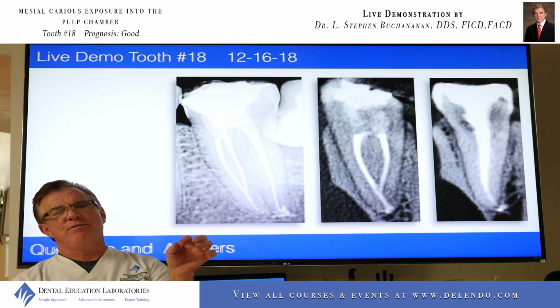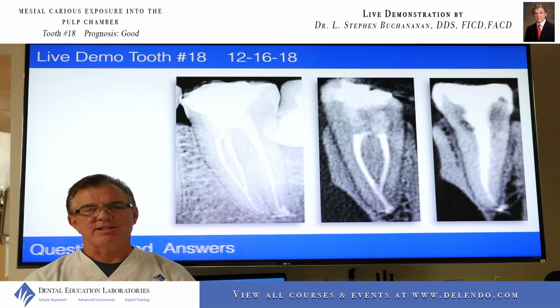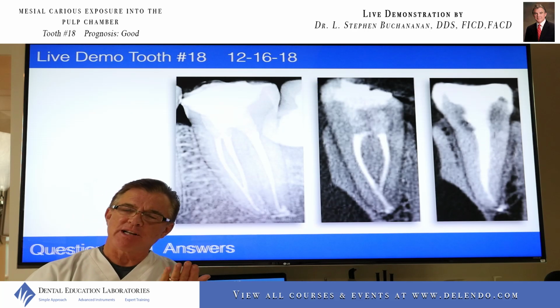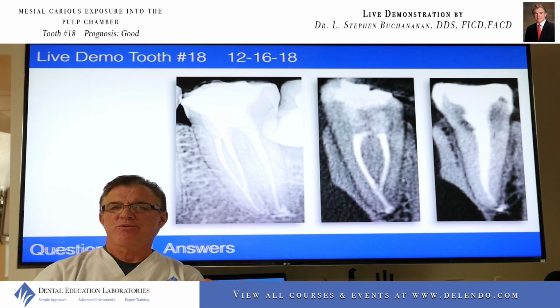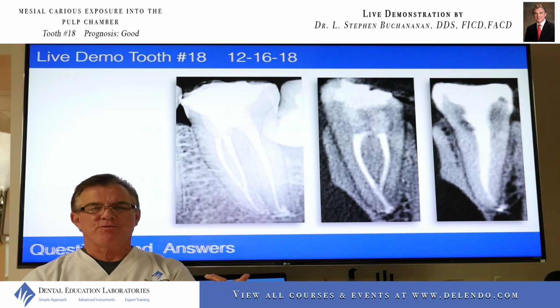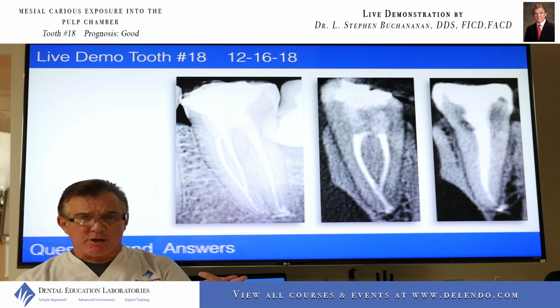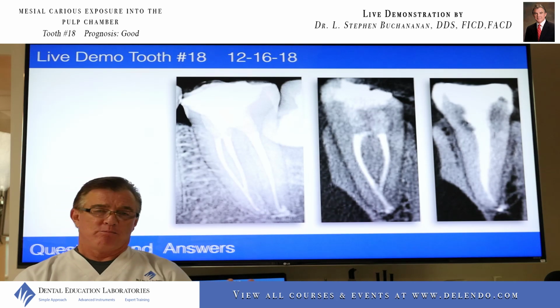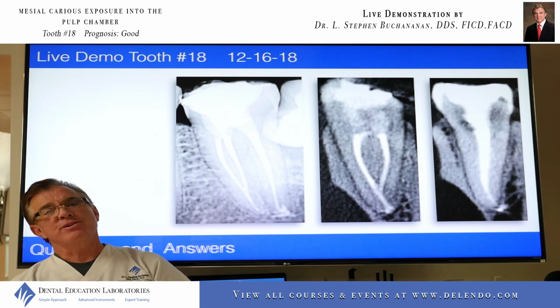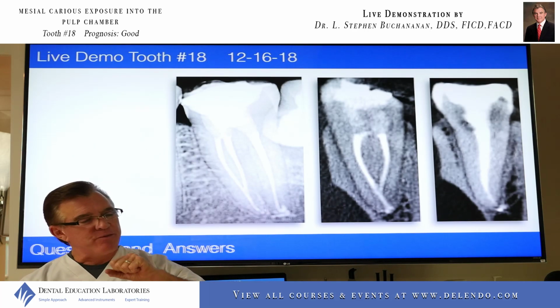Even in the single cone fill though, when I'm cementing the cone and most of the lateral anatomy is filled during that cementation process, I'm still going to sear the cone off at the orifice, and I'm going to hang out there for 2 or 3 seconds with the elements-free continuous wave electric heat plugger so I can heat the gutta percha there. Then I'm going to take a plugger that matches the diameter of the canal. Mine are usually 1 millimeter in diameter, so I use the fat end of the red #1 continuous wave hand plugger. It's 0.9 millimeters, so it fits perfectly in the orifice.